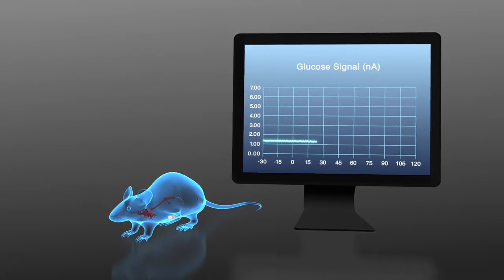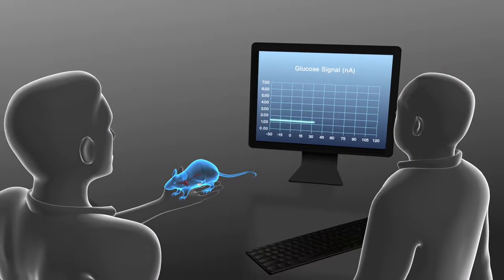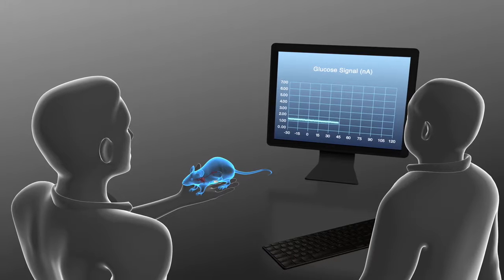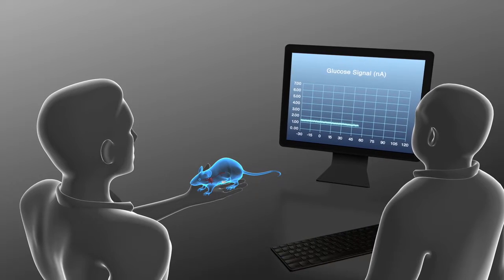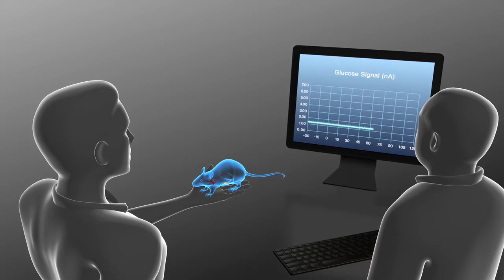The calibration process should be conducted by two people. The first person records calibration values on the computer and informs the second person when to draw samples. The second person handles the animals, collects blood samples, and reports the calibration values to the first person.